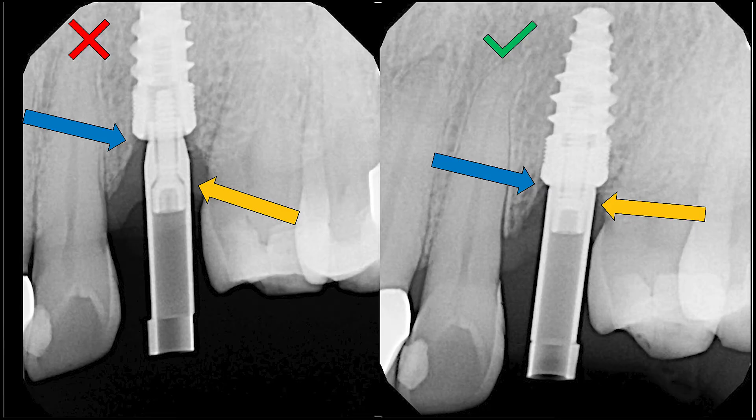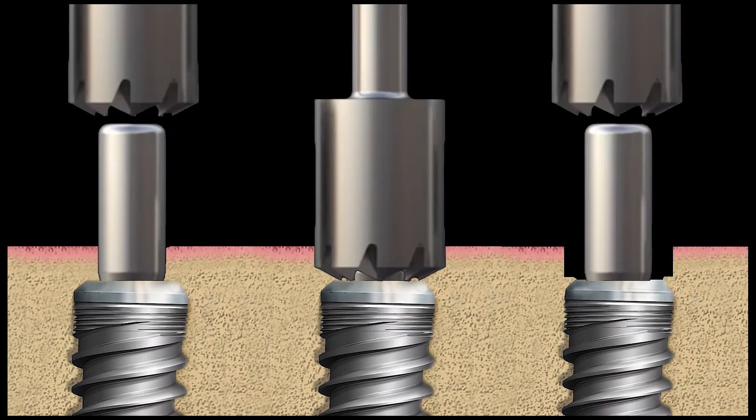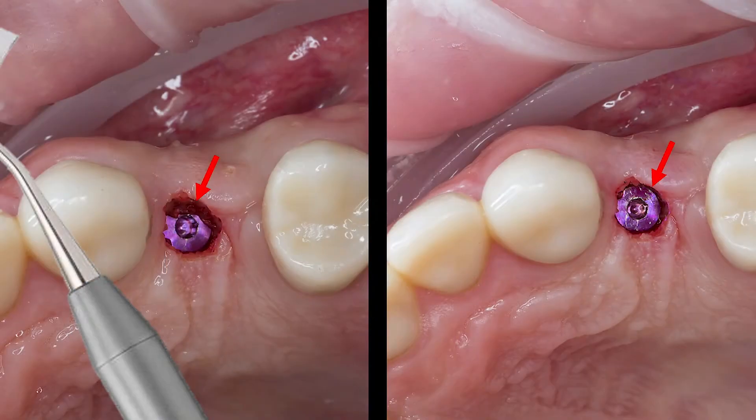If bone is in the way, you can go ahead and recontour the bone using a bone profiler or any other instrument to help scrape the bone off of the platform. Ensure you are utilizing a cover screw or healing abutment to protect the connection of the implant when doing so.